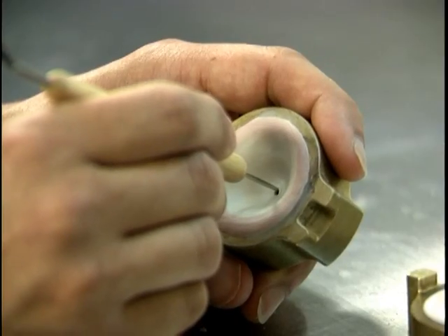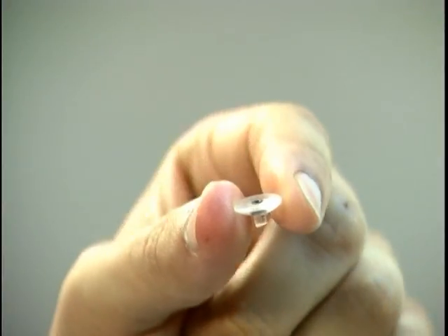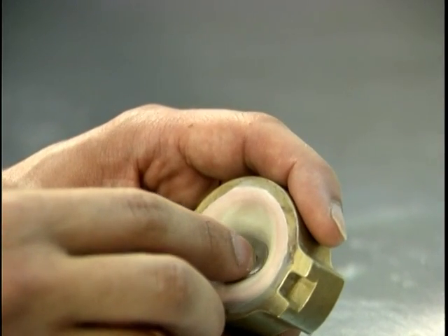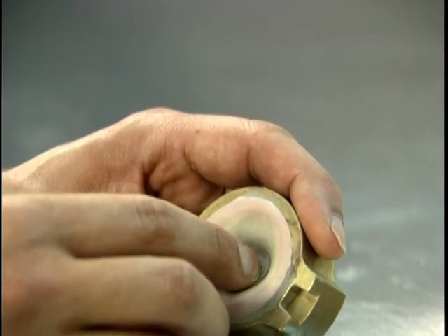Next, puncture the clay to allow room for the iris button. The iris button is introduced to create the iris size and register the orientation of the pupil. It also maintains the iris diameter, ensuring a perfect circle during the painting process.